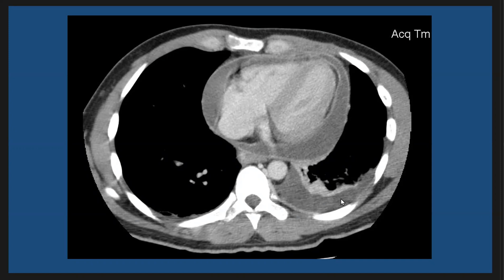We also have left-sided pleural effusion with enhancement of the pleural layers — the visceral and parietal layers. This is a pleural split sign and a pericardial split sign. There is also associated subsegmental atelectasis.